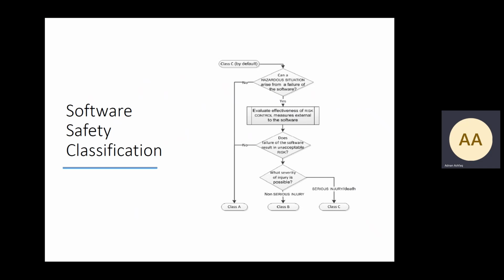And external to the software can actually be a clinician who makes the decision. So for instance, if you have an algorithm or machine learning which is making decisions, there's a much higher risk involved, as opposed to if somebody else is making the decision from clinical information or data which is being provided to the clinician. So therefore the risk is much lower.